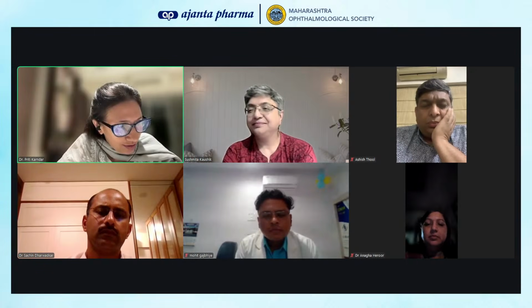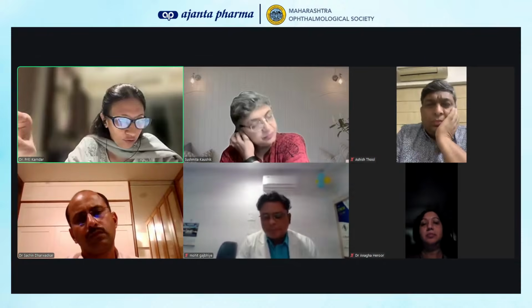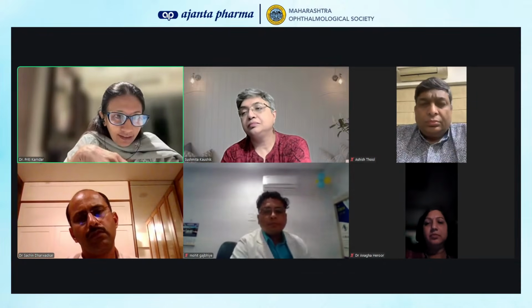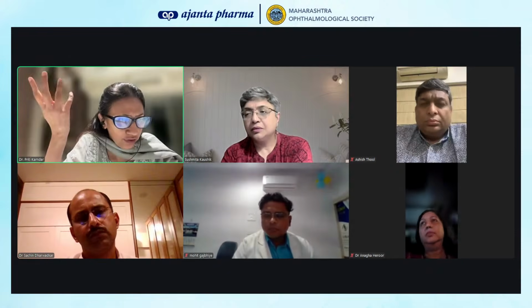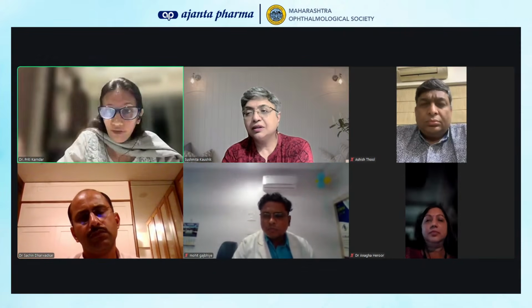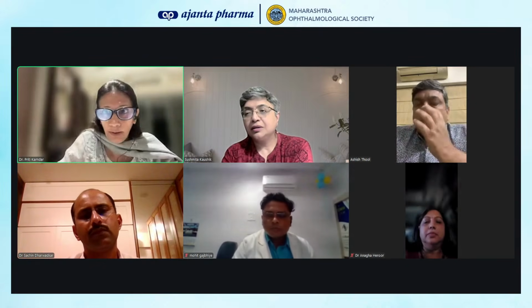And now, does every patient of glaucoma or ocular hypertension undergo a screening OCT? This is the question. Does every patient go through the screening OCT for early detection? I don't know what the person means. Every patient, obviously, we are not going to do OCT. I think every glaucoma suspect is what the person probably means.